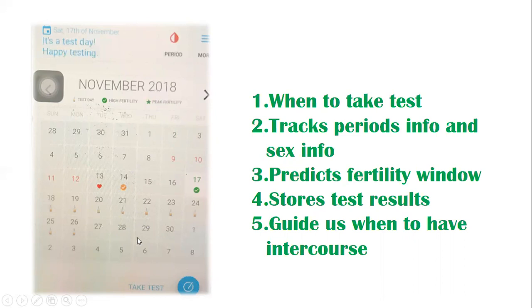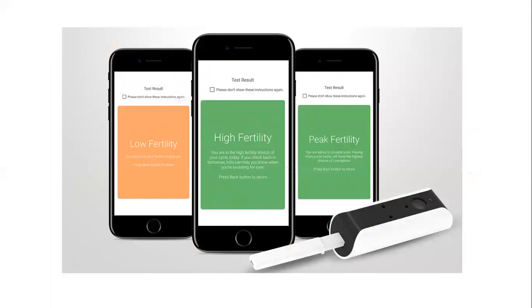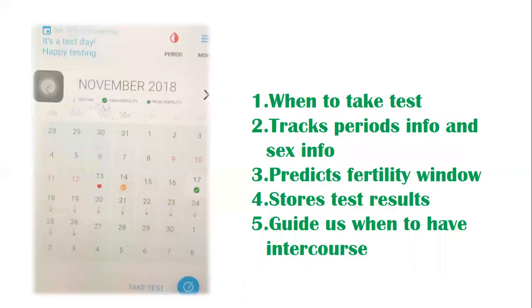The app also guides us on when to have intercourse. For example: 'You are not in your fertile window yet, press back button to return.' Or: 'You are in a high fertility stretch of your cycle — check back tomorrow.' Or: 'You are about to ovulate soon — having intercourse today will have the highest chance of conception.' This is the take-test icon; when you press and the device and strips are connected, you will get the instructions.